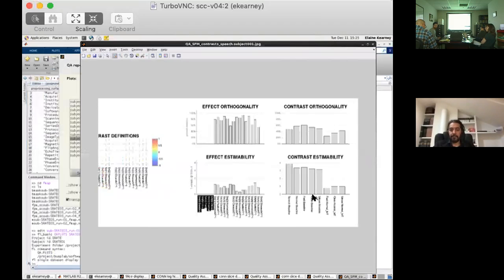Okay. If there was nothing else from anybody else, I was running the surface-based pipeline through to the second level. Right, I saw your message. I'm still working on that. I'm trying to integrate the whole second level results display for the two pipelines into one script. So I think if I have that finished, that will resolve your issues automatically, because the volume-based permutation analyses are all very robustly defined, and I think this is just something residual for the surface-based permutation analysis, which I haven't looked at in a long time. So yeah, I'm working on that. I'll have an answer for you as soon as possible. Supposedly a day or two.